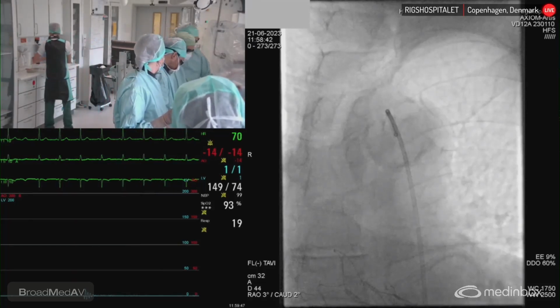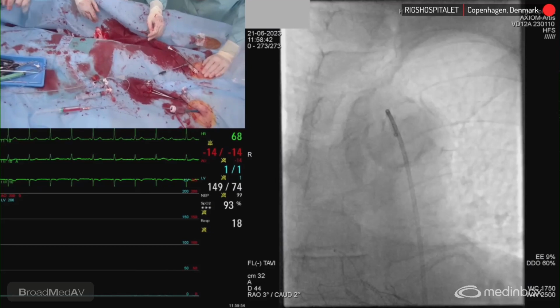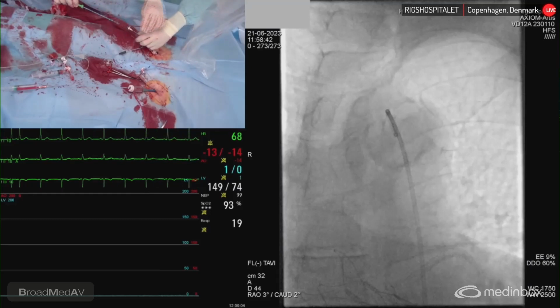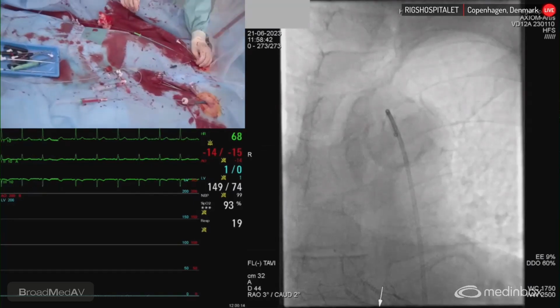All right. So what we're going to do, my idea here, of course in a more urgent situation, would be to place a 12 French. I think we're going to change this just to a 10, let the vessel accommodate around the 10, and then we just close it with 8 and 8 Angio-Seal, or maybe we could put just one ProStyle and then the 8 and a 6 or 8 Angio-Seal. So we don't need anything additional for that. Let's check it on the fluoro.